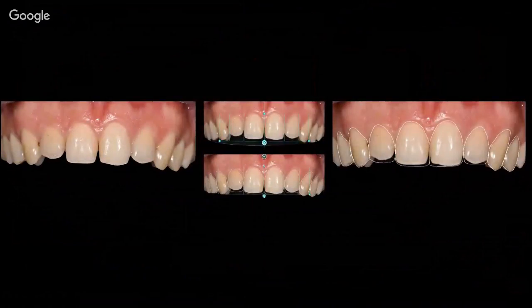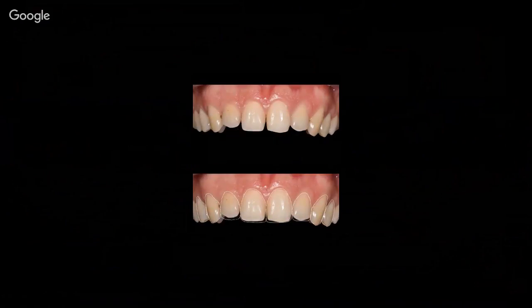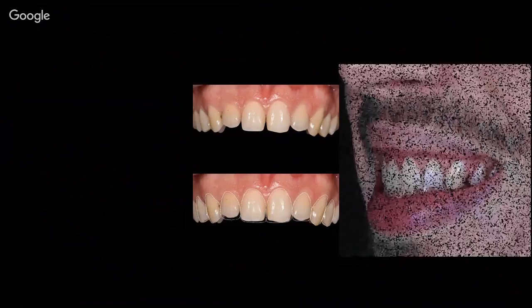And very easy case here as well. We just need to add some dentin or body, and then some enamel, and play, as I just showed you, play with the shape, the vertical grooves, the embrasure, to make it natural. And let's see. So that's the beginning, that's our project, and that's what we achieved.